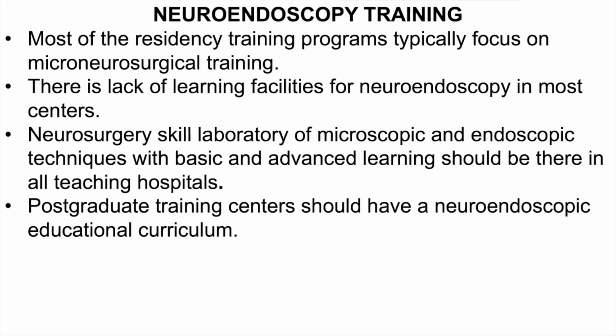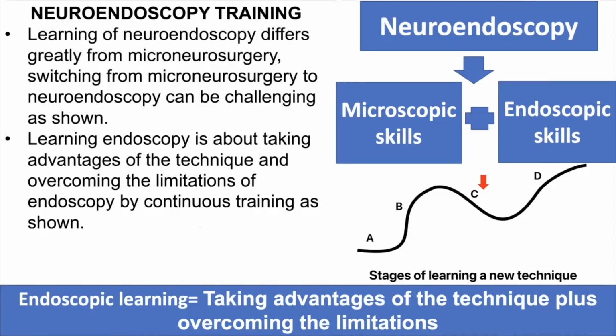Postgraduate training centers should have a neuroendoscopic educational curriculum. Learning of neuroendoscopy differs greatly from microneurosurgery. Switching from microneurosurgery to neuroendoscopy can be challenging.